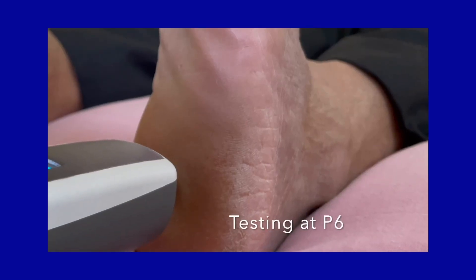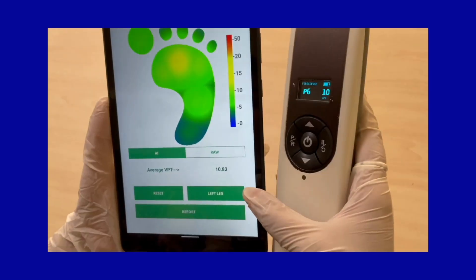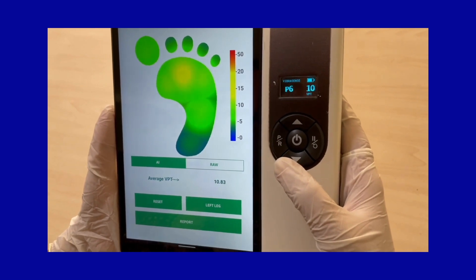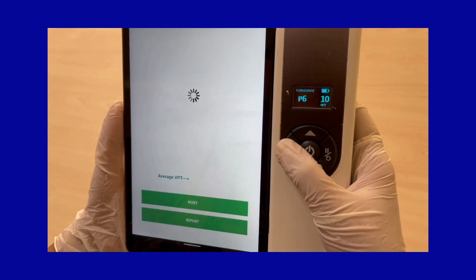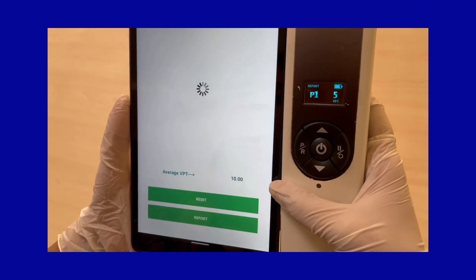After completing the testing at P6, go to the app screen and press the button for that foot. Then long press the PR button on the device — this will generate the report for that foot.